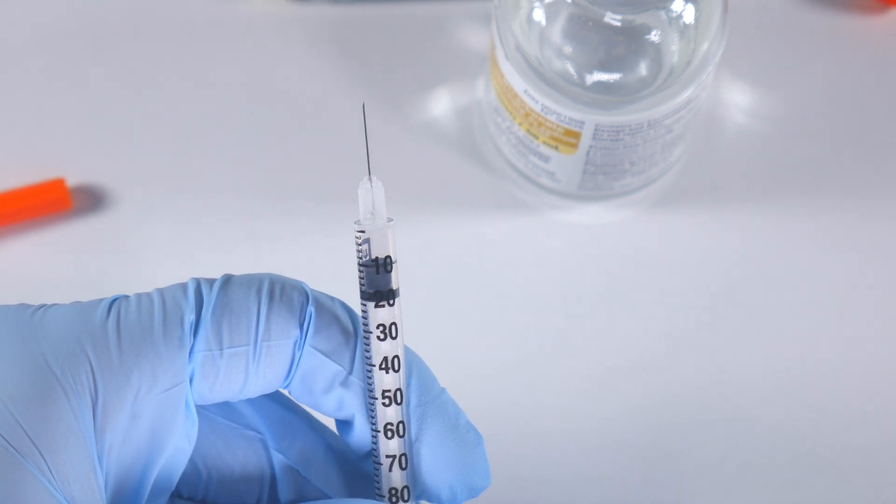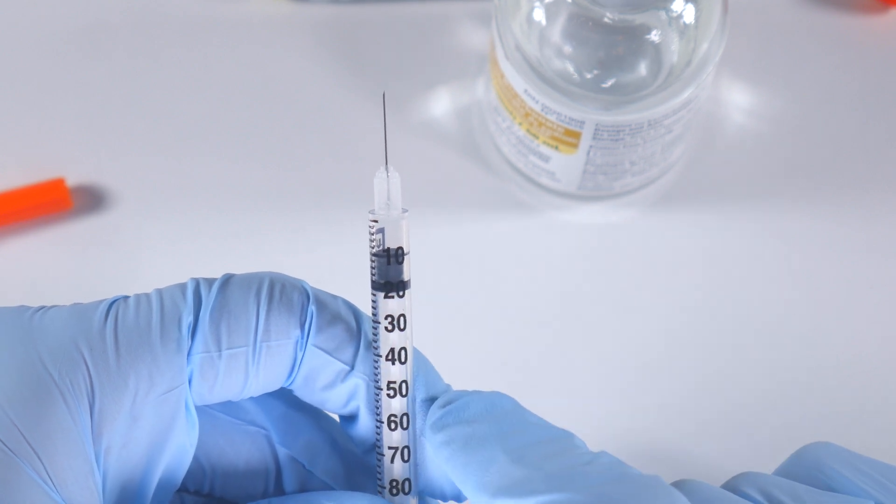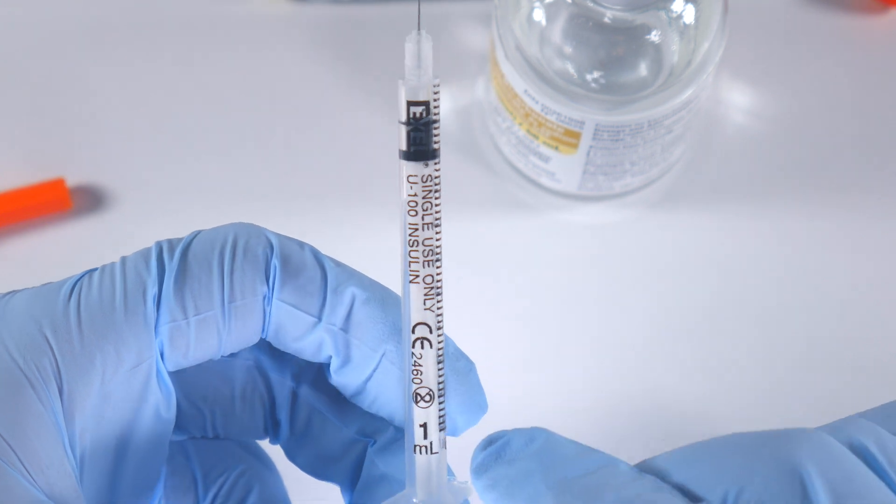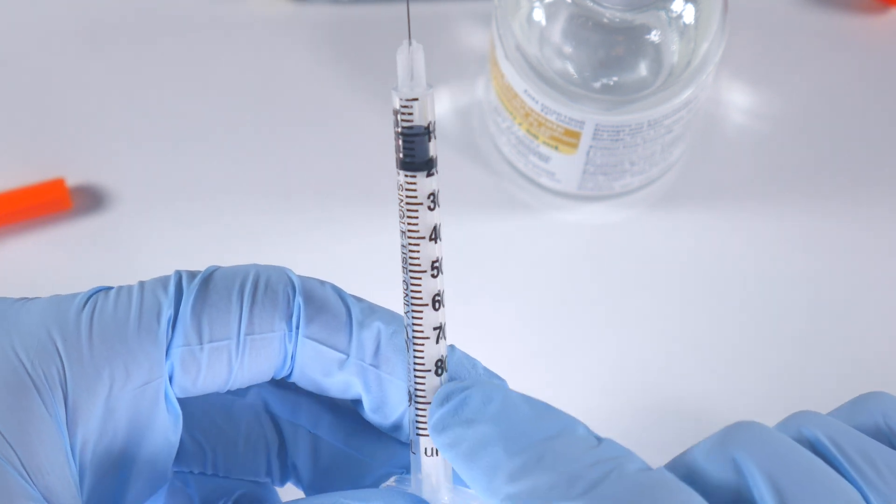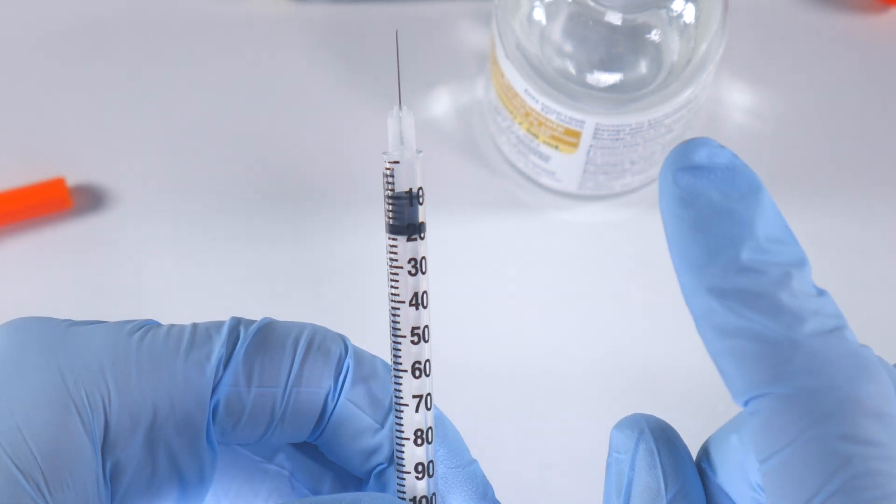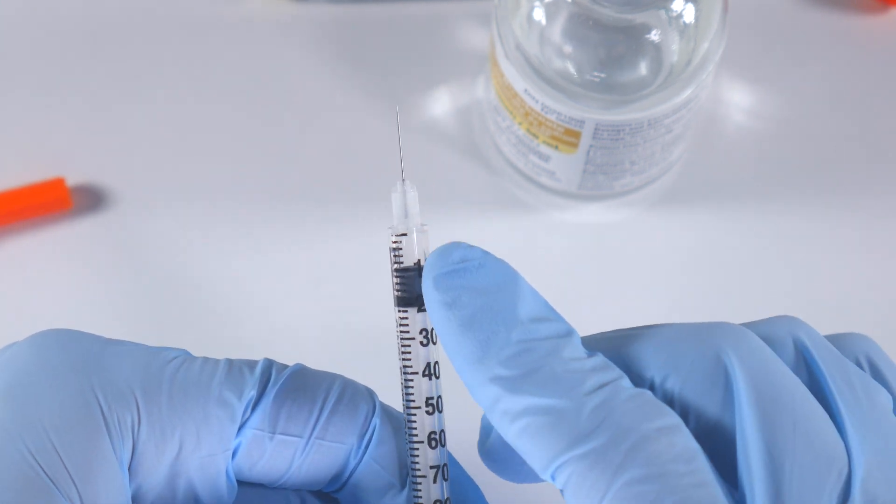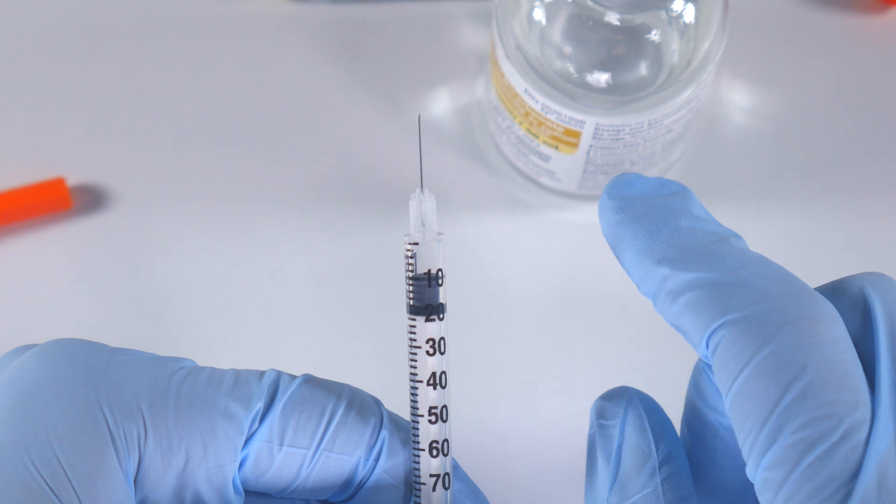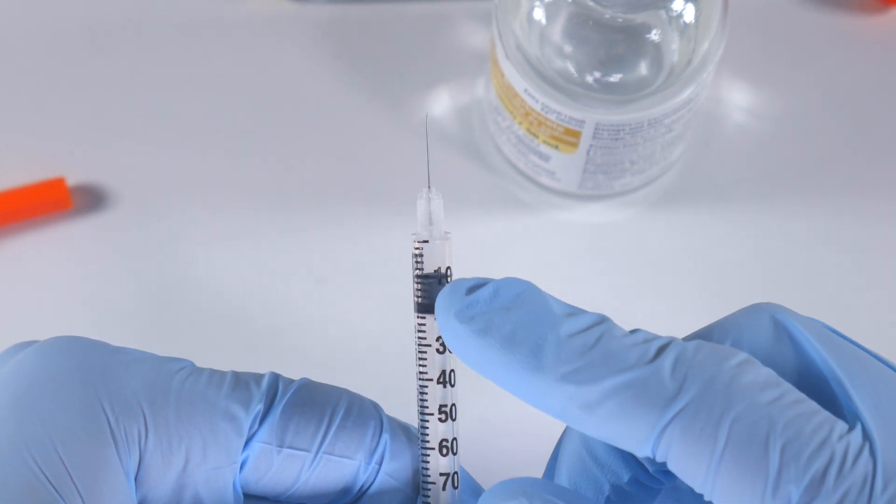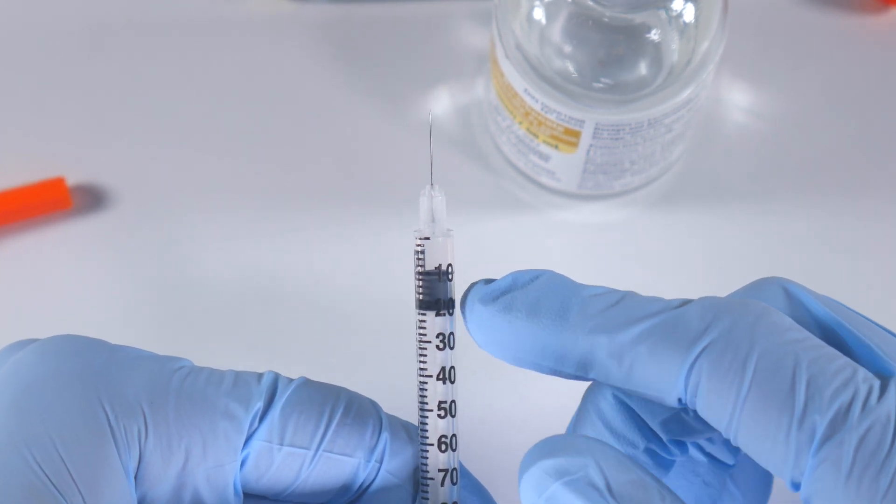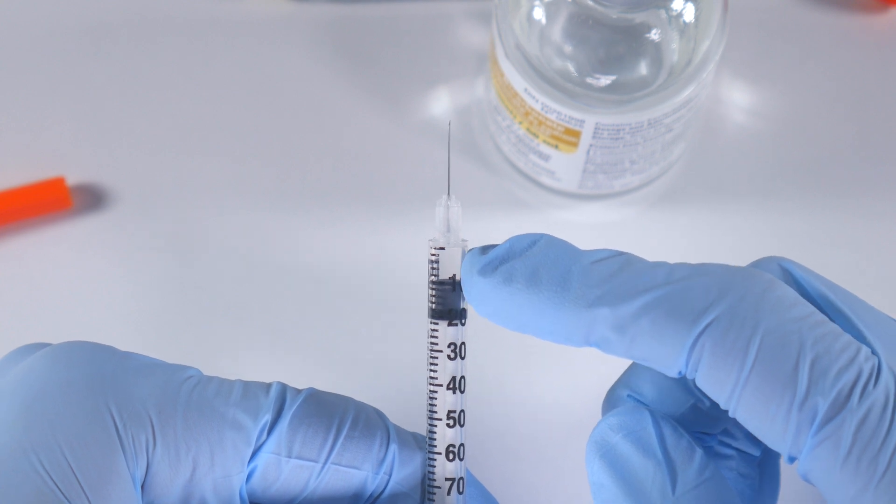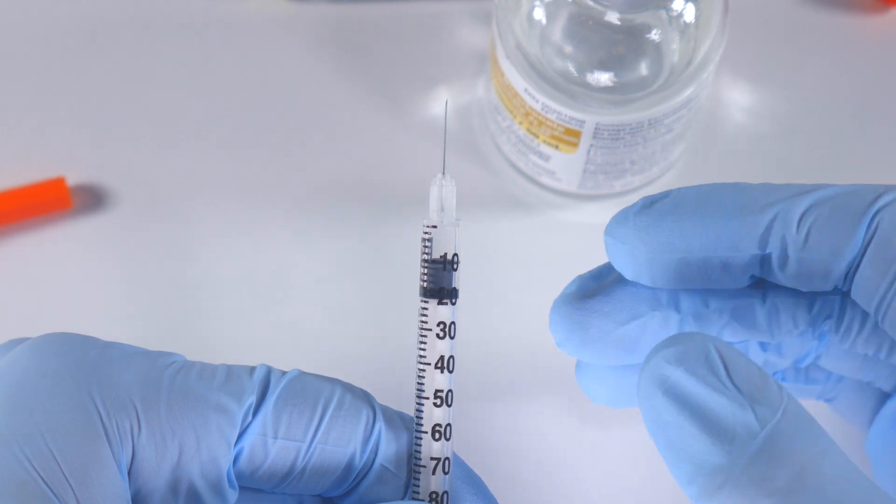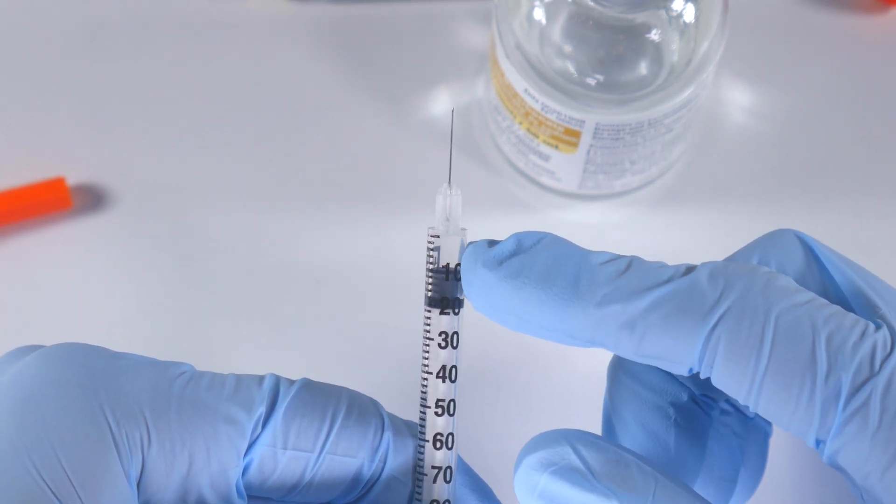At this point we're going to pull back the plunger to the 10 on the syringe. Now remember that the 10 denotes 0.1 mil—it's not 10 mils, this is a one mil syringe, we're dealing with a tenth of that, which is 0.1 mil. So once you draw that back, you're going to take this, express the air into the vial, and then you're going to draw back again to the 10 on the syringe, which allows you to ensure that you've avoided any air in the syringe. When you draw back the solution, the sodium bicarbonate, it's not going to have any bubbles within it.